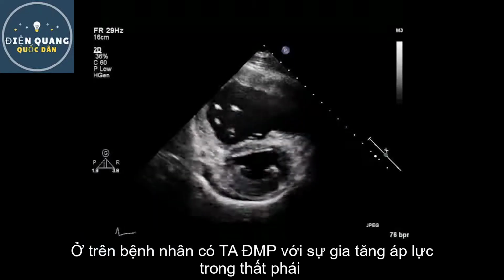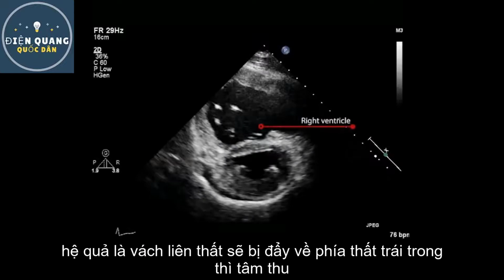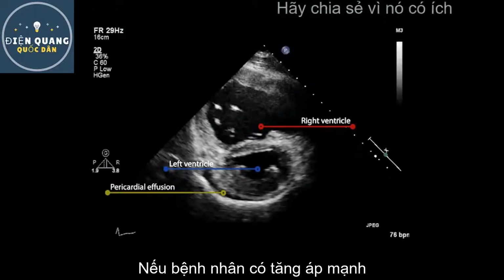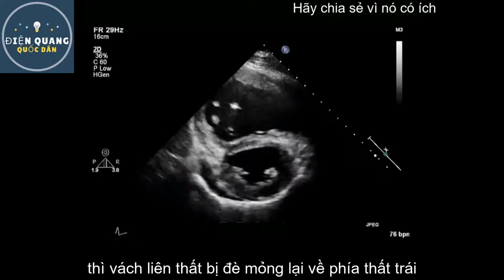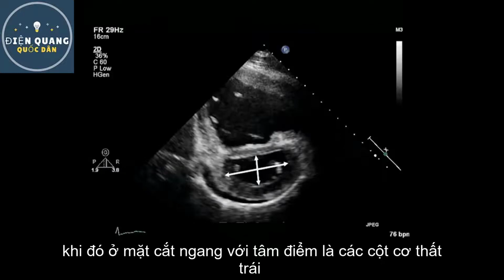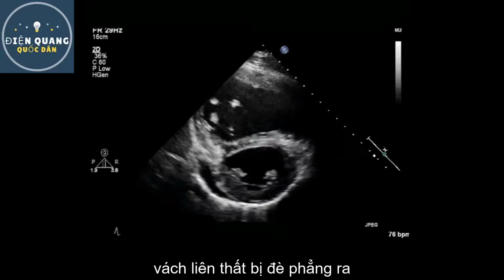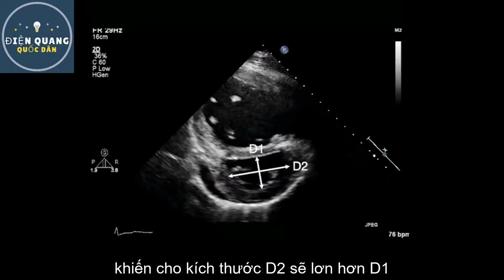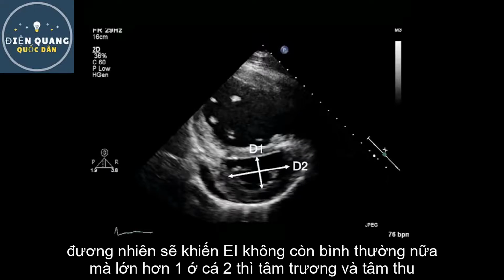In pulmonary hypertension, a pressure-loaded right ventricle results in a shift in the septum towards the left ventricle during systole, giving a characteristic D shape of the left ventricle. In severe pulmonary hypertension, the septum may even lie within the left ventricle itself, as can be seen in this short-axis view at the level of the left ventricular papillary muscles. The flattening of the interventricular septum towards the left ventricle results in D2 being greater than D1, which results in an abnormal eccentricity index that is greater than 1 in both diastole and systole.